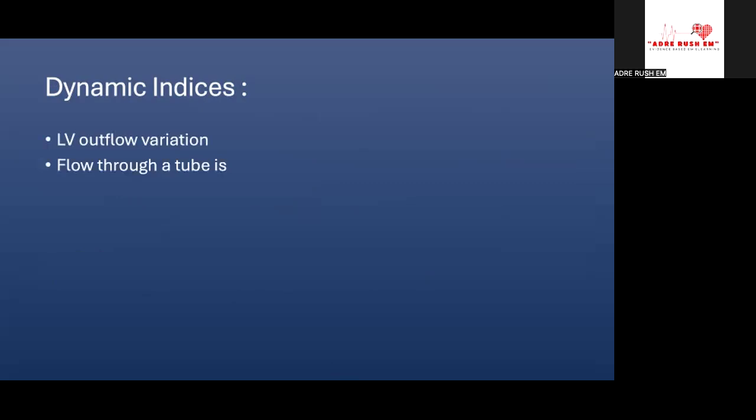How do we estimate that? This is nothing but calculating your cardiac output using your stroke volume. First, you estimate your stroke volume and then you multiply it by the heart rate to get your cardiac output. How can I get a stroke volume? As we all know, consider the aorta to be a tube. So you are going to measure the flow through the tube. How will I measure that? It is measured as velocity times the cross sectional area at a constant flow.